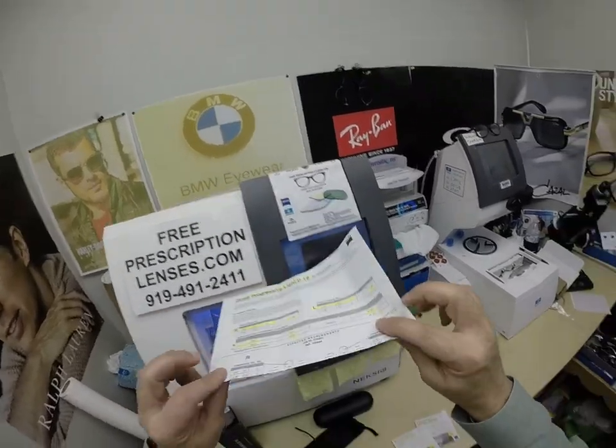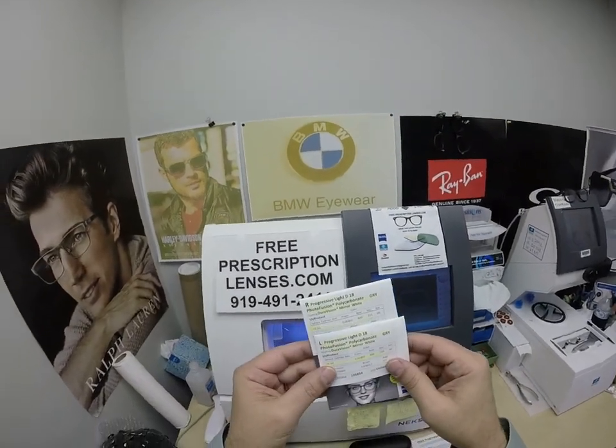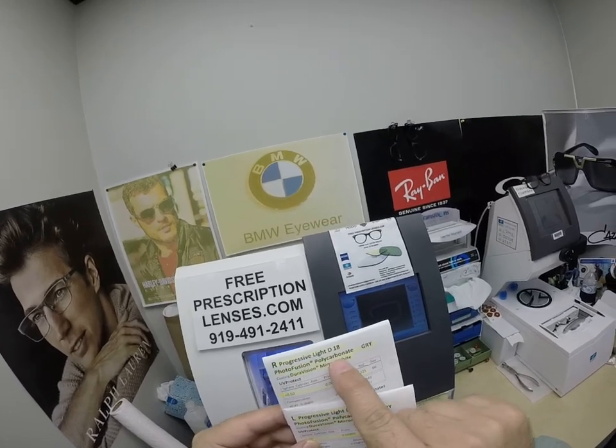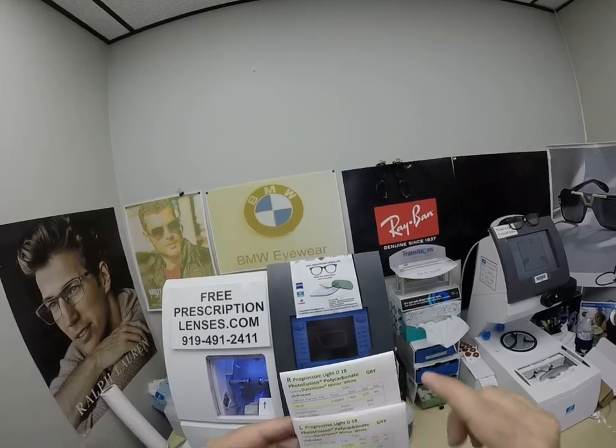On this 8x11 compensated form for your records, you get all the packaging from Zeiss. I've highlighted the prescription for the right eye — the Progressive Light D Photofusion Polycarbonate Extra Gray with the DuraVision Mirror White.